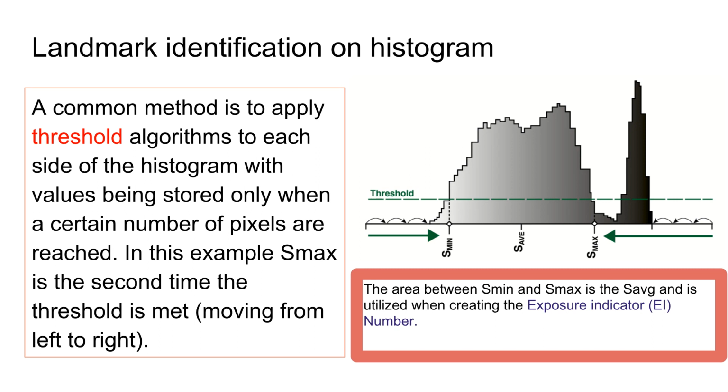So you just determine where am I going to start counting pixels? Like what is that lightest gray level before I call it the minimum? Or what is my darkest grayscale? So that area becomes our basic data that we're going to butt up against the lookup table.